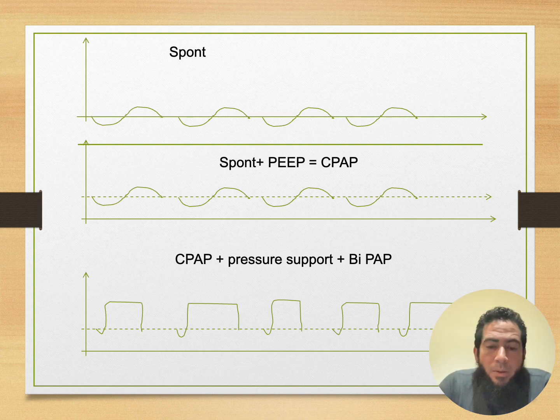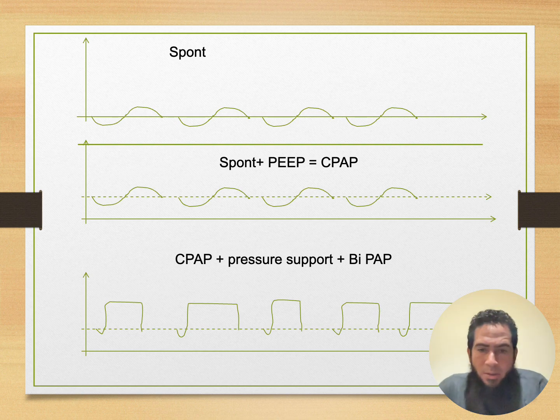Because we have already spoken about SIMV, which is synchronized intermittent mandatory ventilation, now we move to the modes we see in the non-invasive machines or NIV machines, NIPPVs or whatever you use in your hospital. To understand CPAP and BiPAP, which are the main two modes available in non-invasive ventilators. By the way, these modes can also be used on invasive mechanical ventilation.